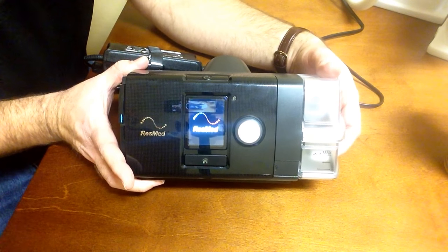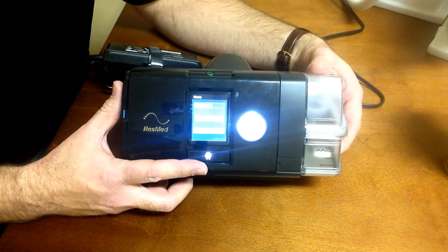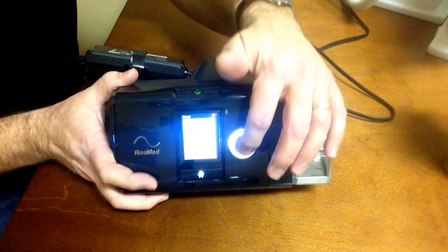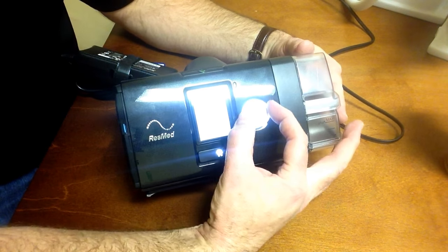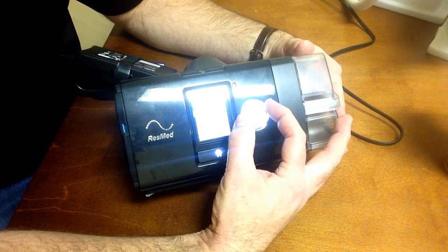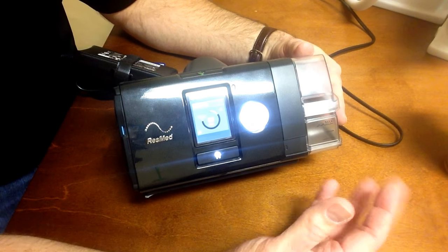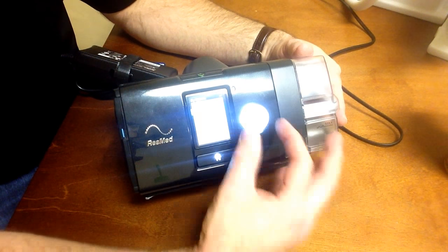Primarily the heat and the ramp function. From your home screen, you'll see options and sleep report. Choose My Options by pressing the push dial, then turn the push dial to go through the menu. I'm looking for ramp time — there we have 15 minutes. You can change that from off up to 45 minutes in 5-minute increments. After reaching your desired setting, click the push dial again to set it.